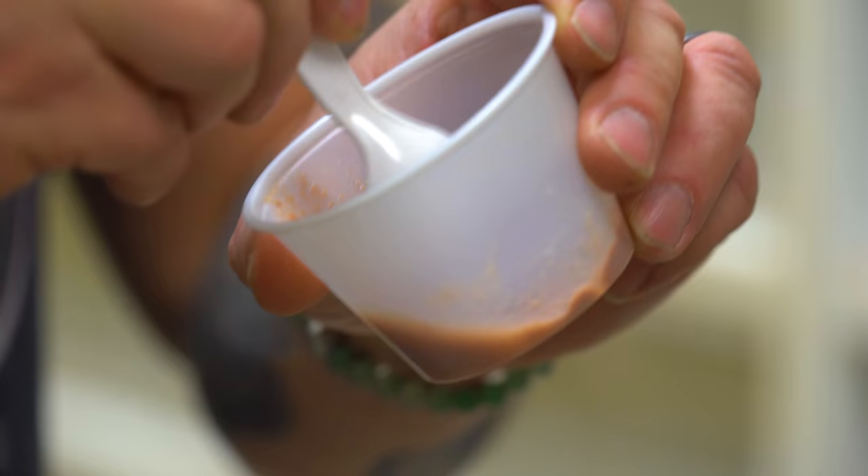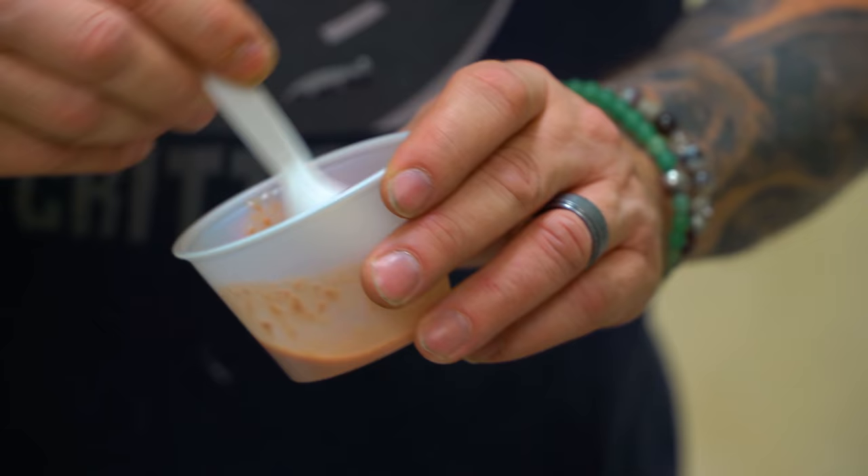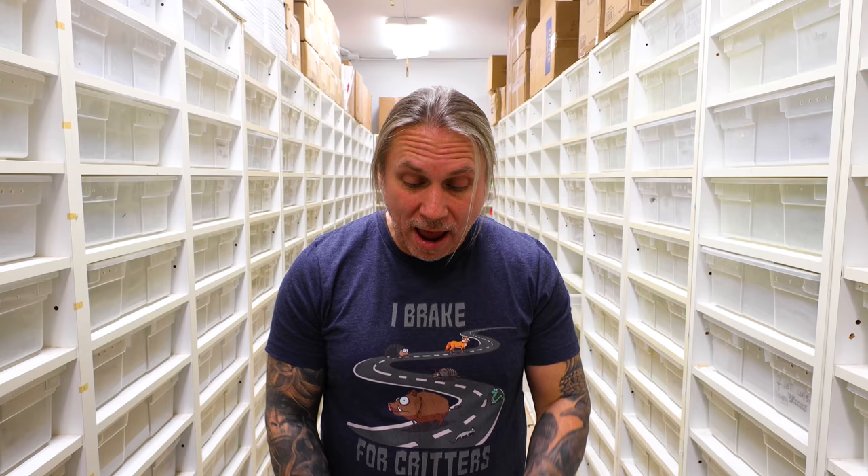I want to make this into a slurry where there's some protein and hydration in here. I'm going to add a little bit more water afterwards because hydration is a big thing. What happened is this sunbeam snake actually regurgitated. Typically we want to give them a week off of food and then feed them a small meal, but unfortunately it regurgitated a second time. That usually tells me there's something going on and some treatment is a good way to go. So let's get the snake and we'll take you through the process.